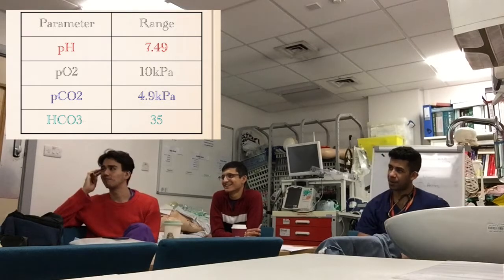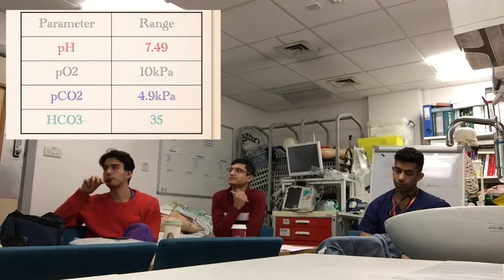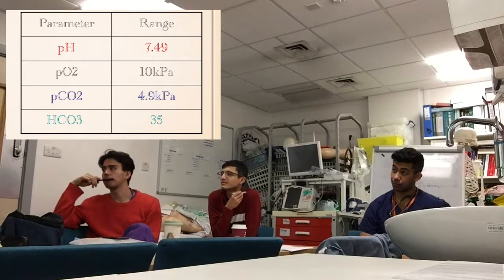Next blood gas. Who wants to take this one? Yeah, sure, go for it. So the pH is high, indicating an alkalosis.